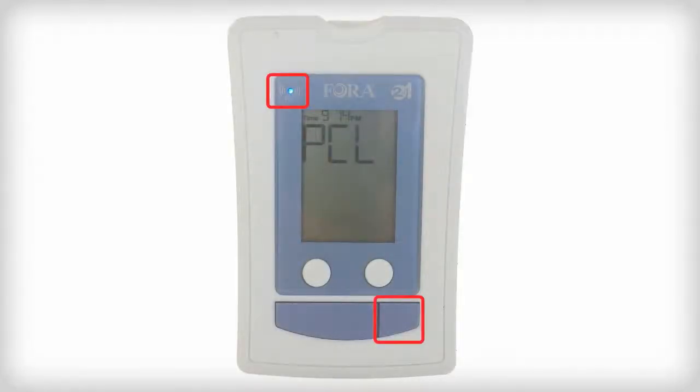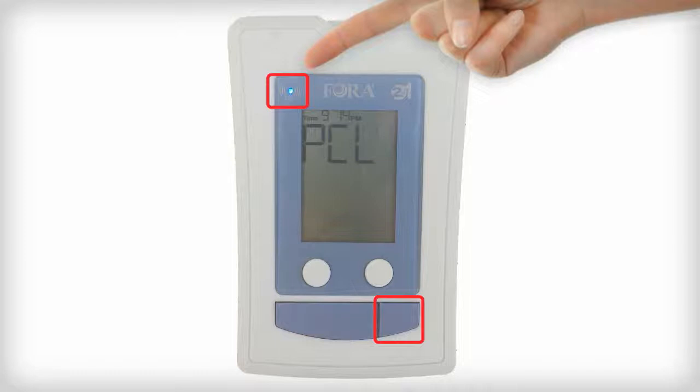On the Fora device, press the Right button for approximately 3 seconds. You will hear a beep and see a fast flashing blue light. The screen should show the letters PCL.